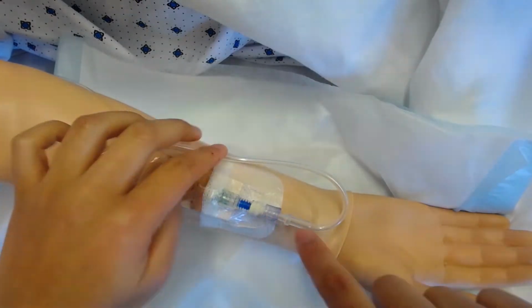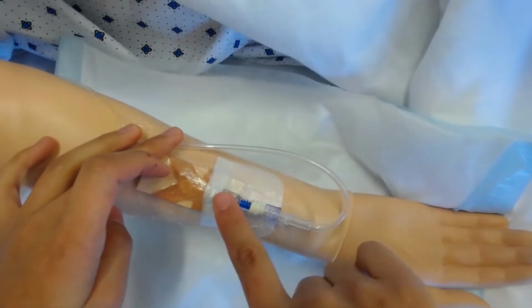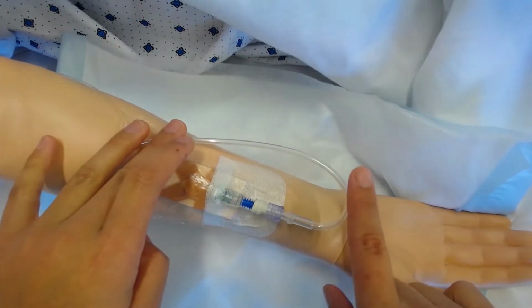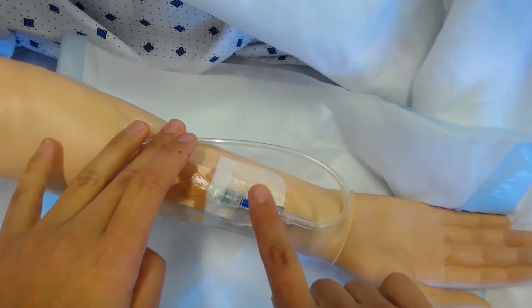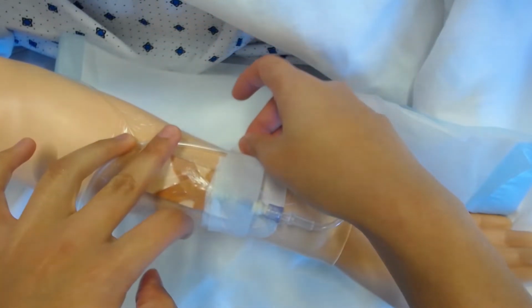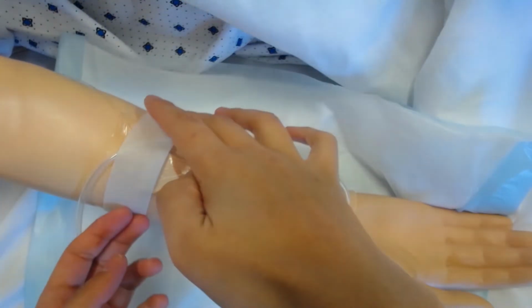I'm taping to secure the IV tubing on the patient's arm. I'm placing a bit of tape over the rigid part of the cannula and over the other side of the IV tubing looped. And this way it's not causing tension or pulling onto the IV tubing and the patient's cannula.